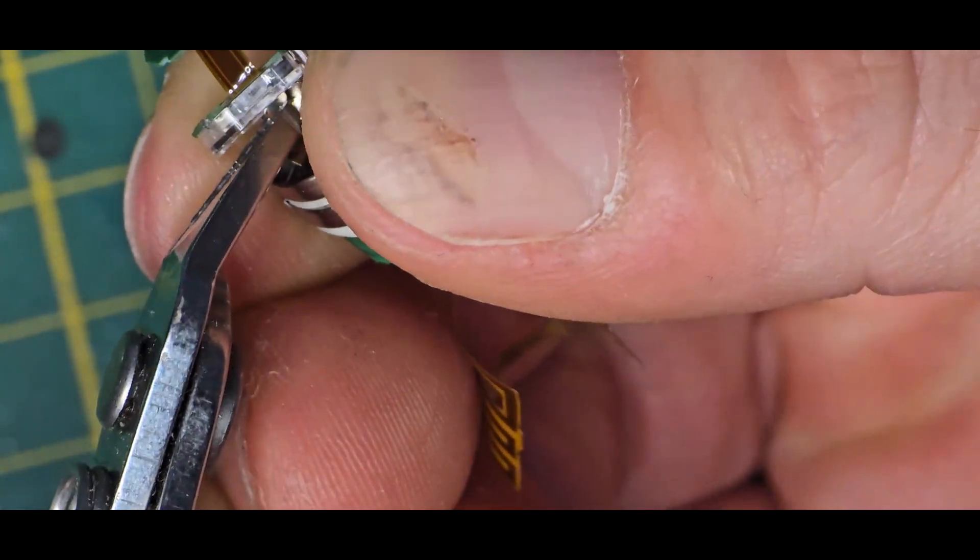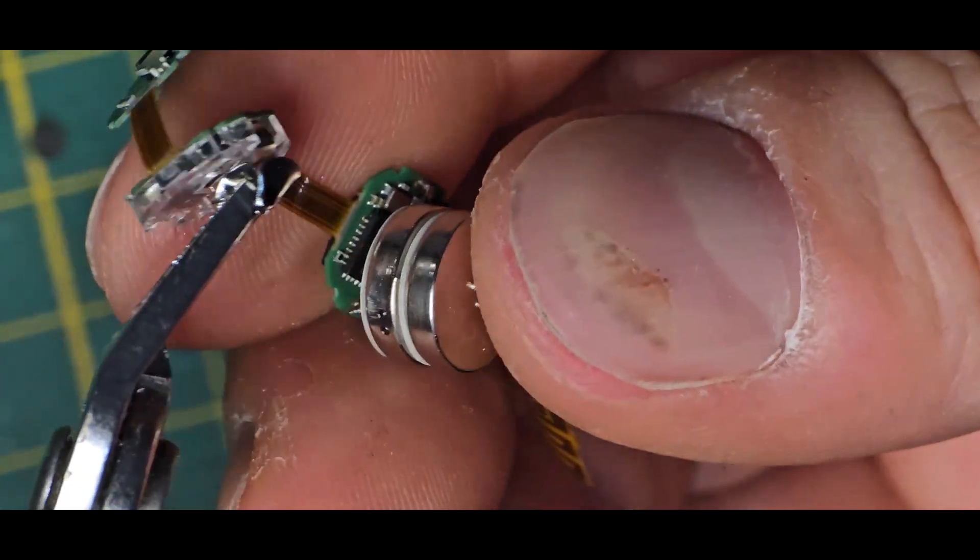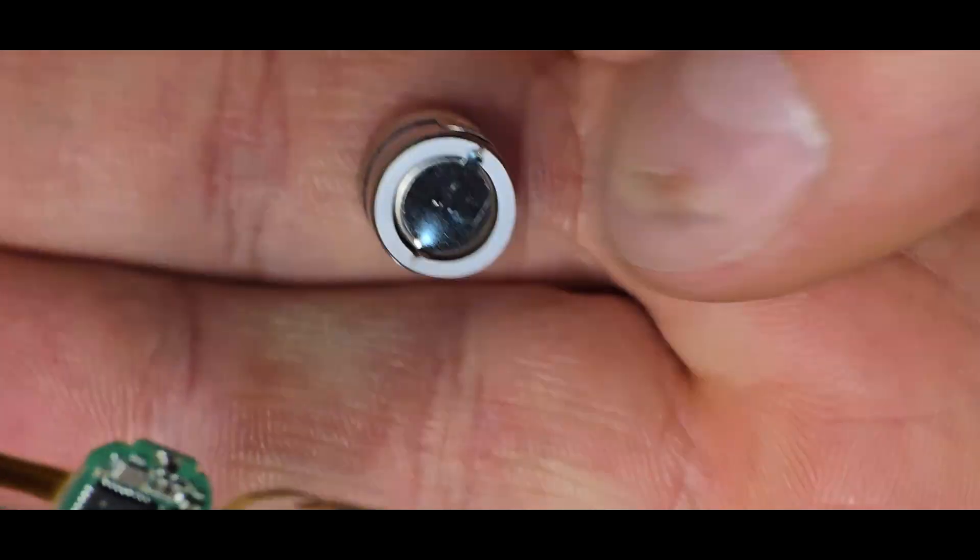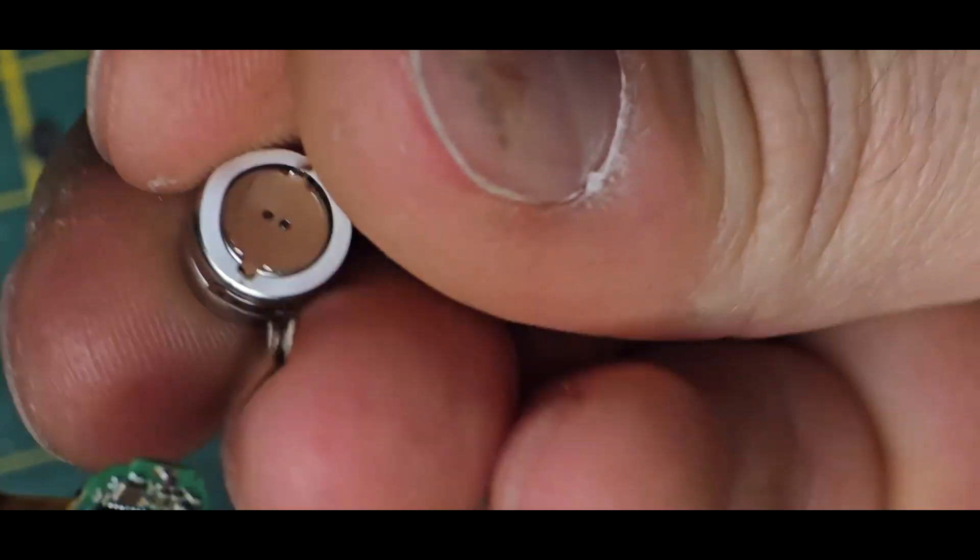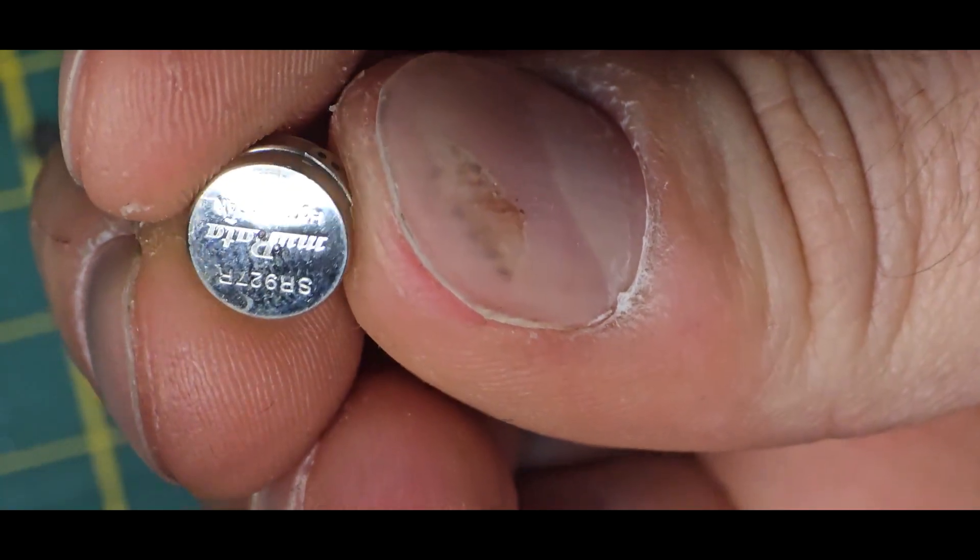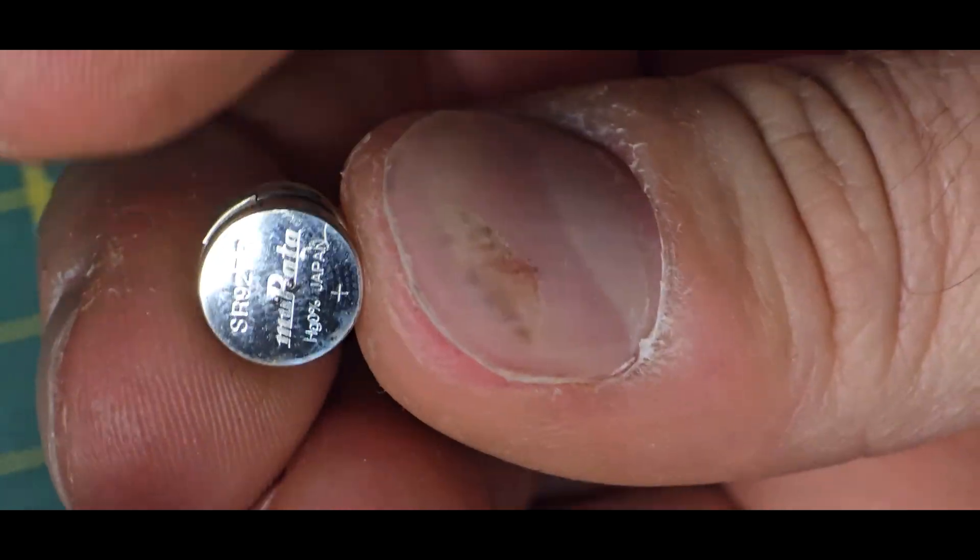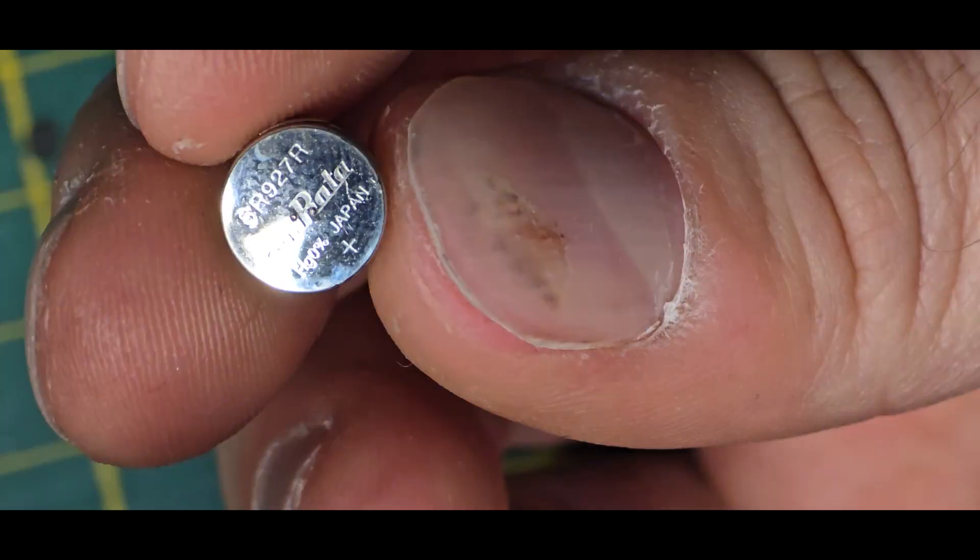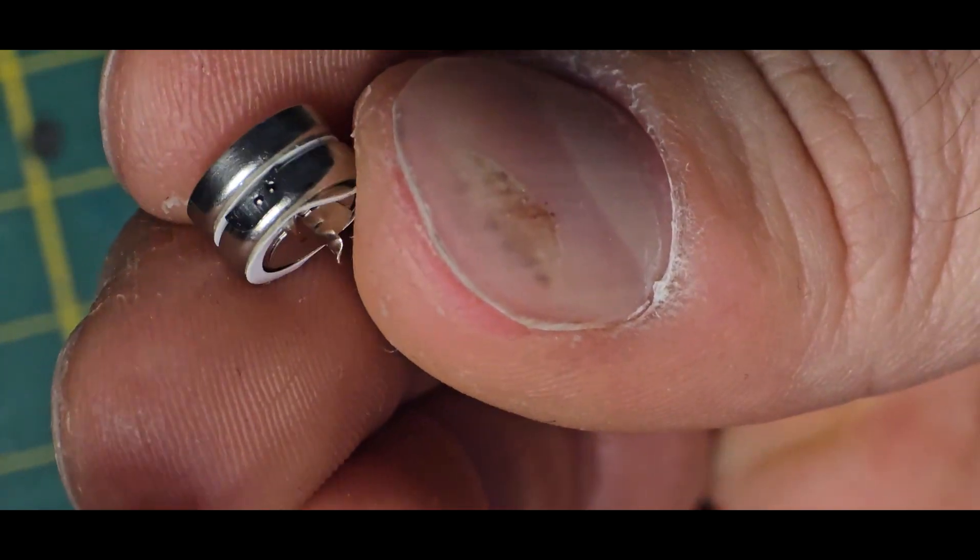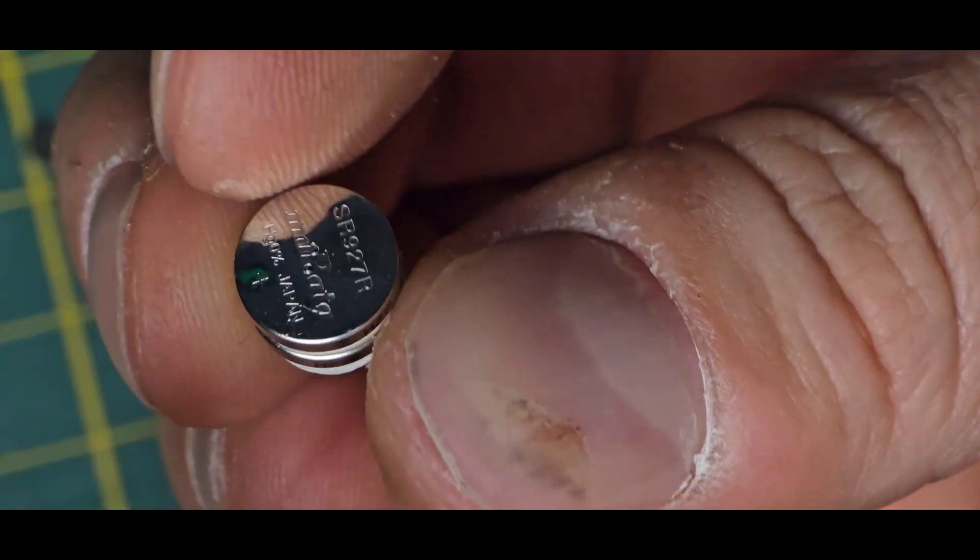So yeah let's just remove it via brute force. And there we go. So we have two coin cell batteries. So it will most likely be somewhere around 3 volts or 6 volts. Not so sure. They are in series.